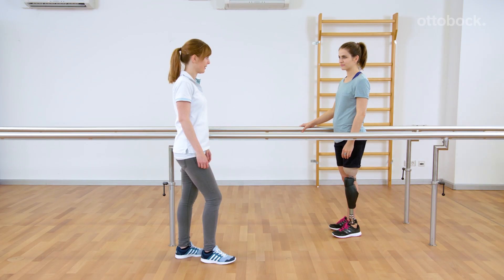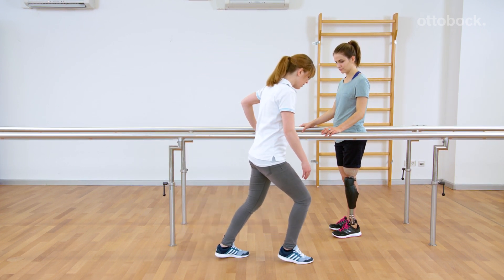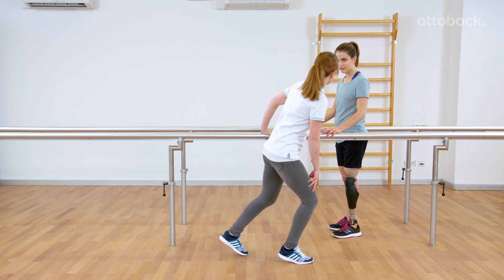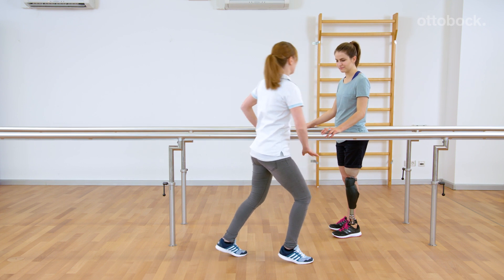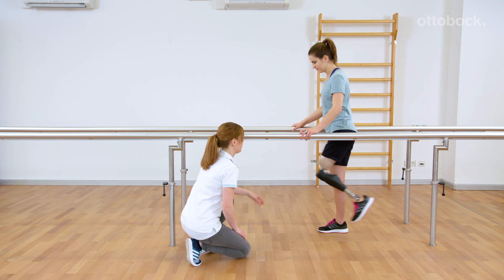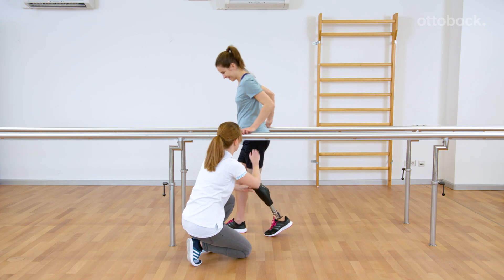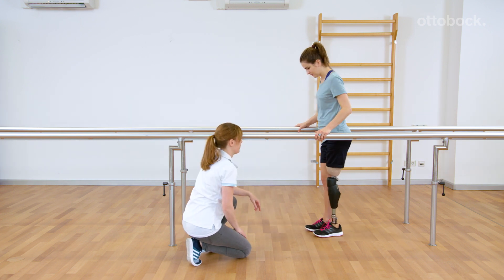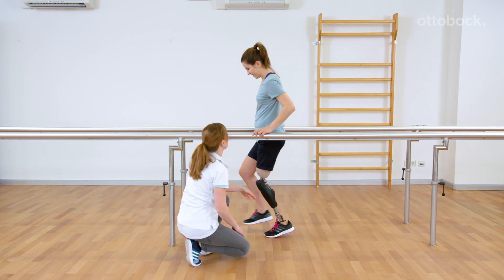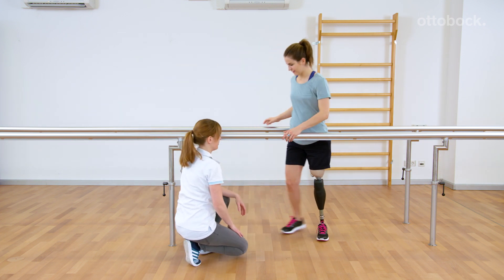It is also possible to use this function and the same motion pattern to step over small obstacles. The obstacles function and the stairs function are actually the same thing. After triggering the function, the user should step forward onto the forefoot, taking a step forward on the locked and flexed knee joint. The user feels that the prosthetic knee joint is blocked against flexion and can be fully loaded.